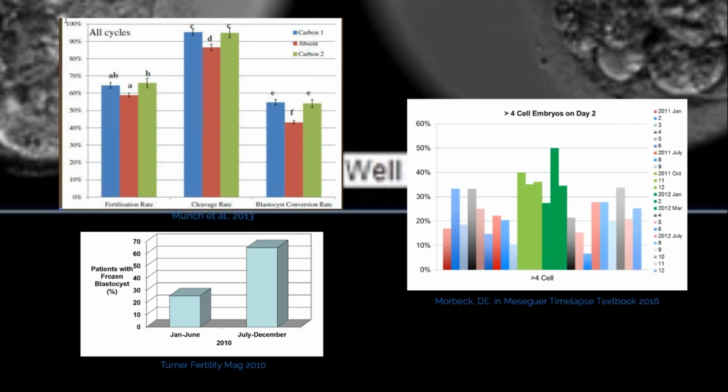It does not prove that the protein was the problem here, but we also know that next to mineral oil, protein is the least defined of the products that we use in the lab, and has been shown to have toxicity in the past. So that makes sense, yet we have no way to say that for sure. But it gives a really nice example of how, again, we can detect a shift.